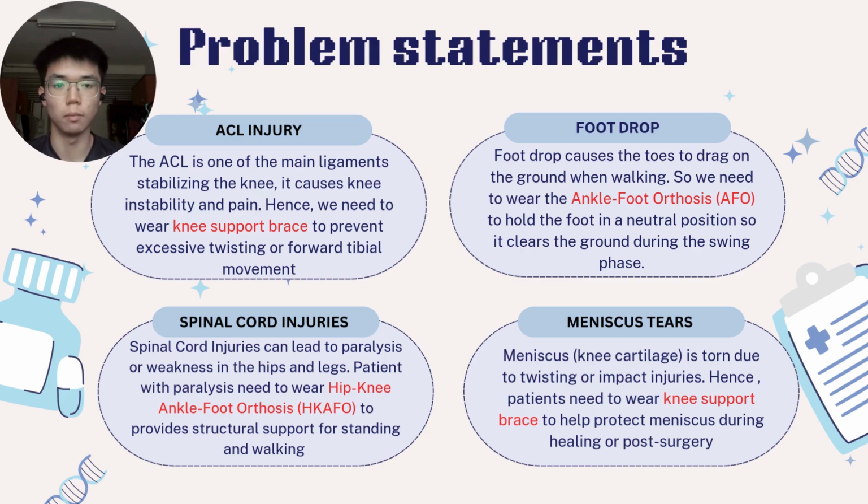The next is foot drop. Foot drop causes the toe to drag on the ground when walking. So we need to wear the ankle foot orthosis to hold the foot in a neutral position so it clears the ground during the swing phase.